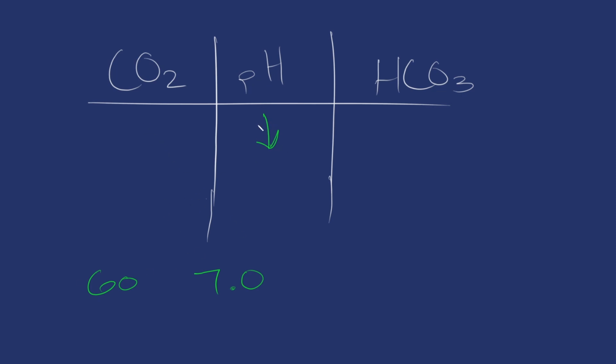And when we're doing these arrows, it's in reference to the pH. Okay, this is one of kind of wonky. It flips it around. It makes it backwards thinking, but it'll make sense in the end. Okay, this is the one that's going to trip you up right here. Now for bicarb, we're going to say that that is 24, right? Right in the dead set of normal.